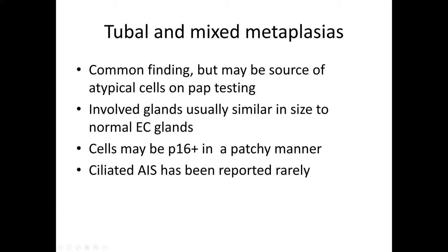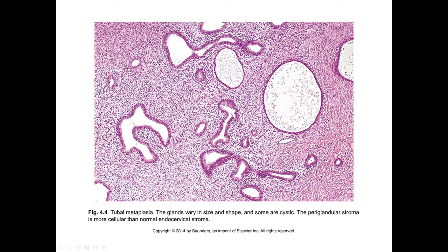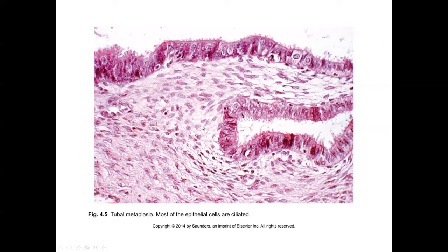Here's an example showing more endometrioid-type stroma with wandering irregular glands and no real mucin content to the epithelial cells. Helpful even at low power is a little bit of splotchy clearing and peg cell identification. That's not characteristic of adenocarcinoma in situ, but is very characteristic of tubal metaplasia. At higher magnification you can see the peg cells with slightly cleared cytoplasm, and notice the nice terminal bars and ciliated epithelial surfaces characteristic of tubal metaplasia.